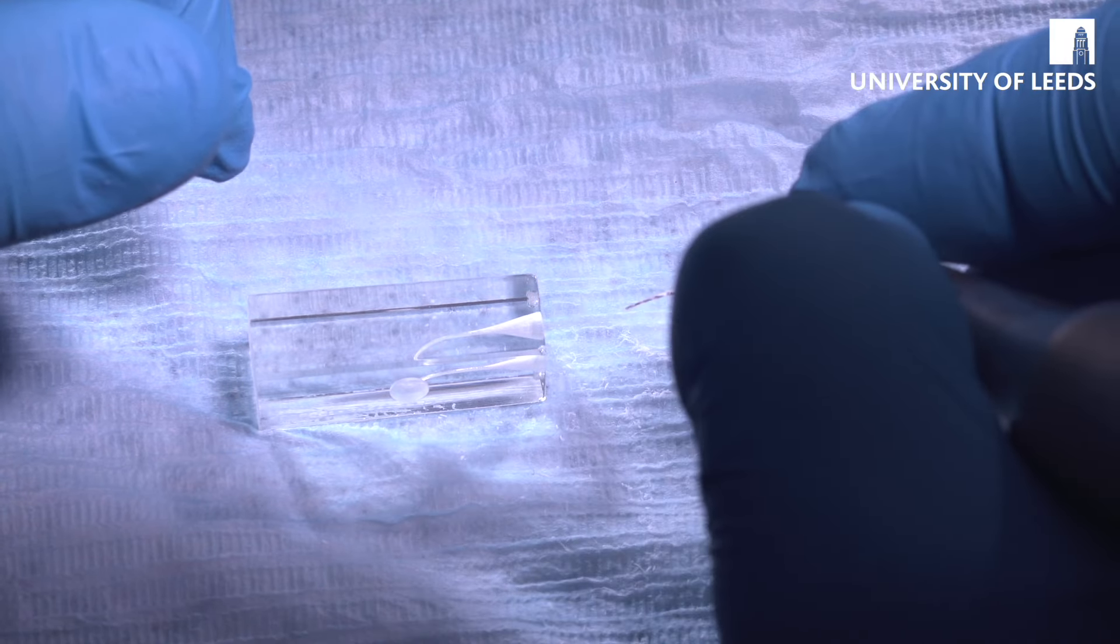So it's the same again - rotating, pushing the file predominantly against the outer wall. A handy tip is if you think of the name of the canal that you are instrumenting, you brush it towards the same cusp. So in the mesiobuccal canal of an upper six, you're going to be brushing predominantly towards the mesiobuccal cusp. In the buccal canal of an upper five, you're going to be brushing towards the buccal cusp, because that's where the vast majority of the dentine is. And that means that you're brushing away from the furcation and reducing the risk of strip perforation. So coronal flare created with this in exactly the same way. You can see there how much dentine debris this will bring out. Clean that up, take the file out again. We stress the importance of irrigation - get rid of dentine debris.